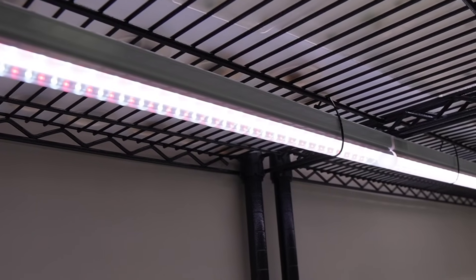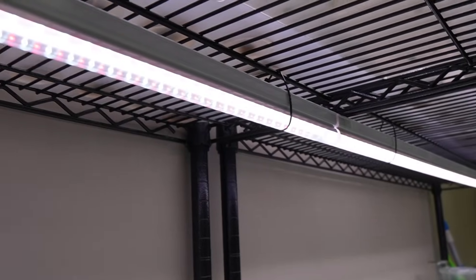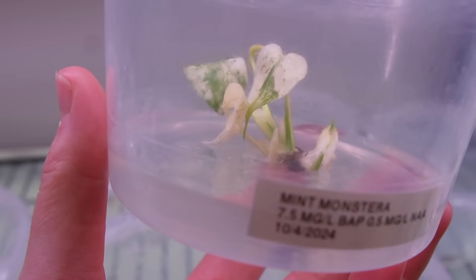Before I get into all of the tools and stocking the laboratory, I wanted to just say my lights that I use for tissue culture are the Nurser 3 grow lights from Horty Power — that's just something that I get asked a decent amount. Next, I want to talk about stocking the laboratory. It is hard to do this part without it turning into a full-blown QVC episode, so I think I'm going to turn my set into a QVC set.